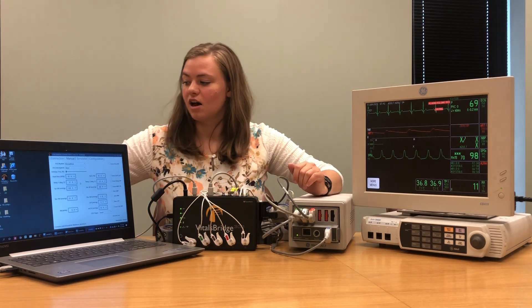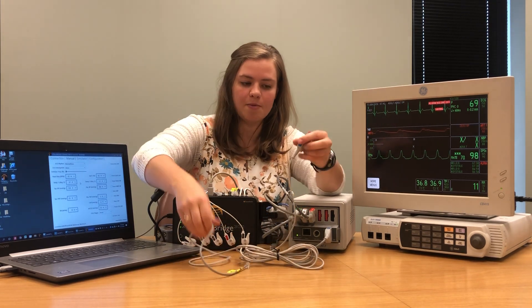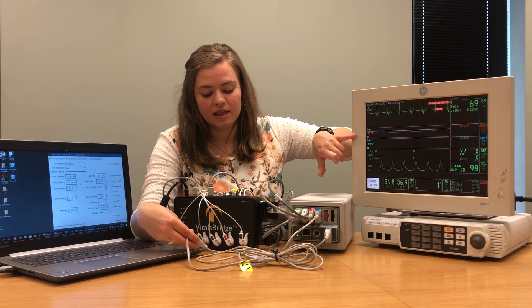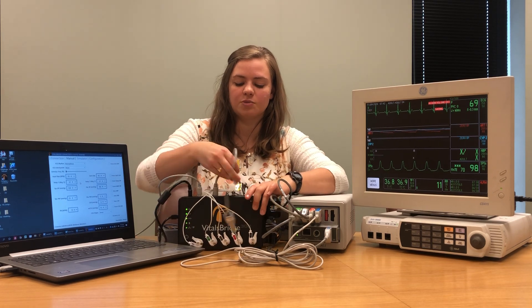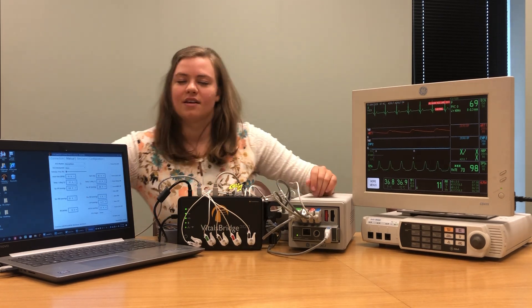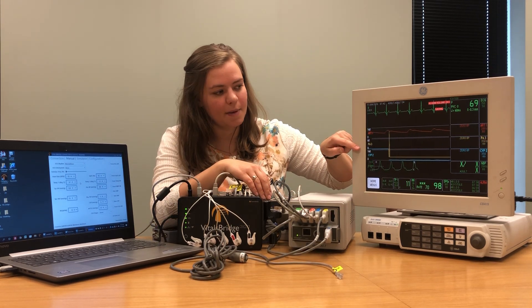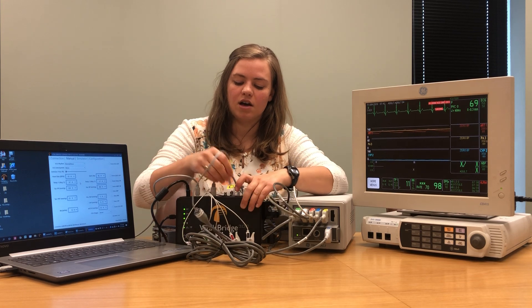Next we're going to connect the second invasive blood pressure cable. I've already connected the cable that came with our VitalsBridge to the patient monitor cable. I'll plug it into the second blood pressure spot on my patient monitor — notice how it says CVP — so we'll plug the other end into where it says CVP on our VitalsBridge. We have one more invasive blood pressure — plug it into the last BP section on the patient monitor and notice how we now have a section for PAP, so plug the other end into where it says PAP on our VitalsBridge.